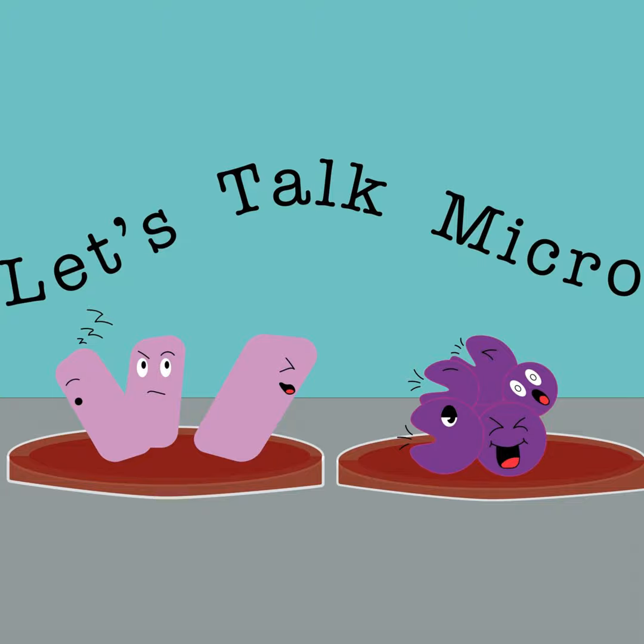So what about next steps? I'm going to let Dr. Alexander touch on it a little bit. What's next for this test? So we have the capability for identifying isolates from solid media and liquid media for AFB. We also have the same capability for solid media for bacteria. That was just recently; I think this week was the first one for bacteria from solid media.